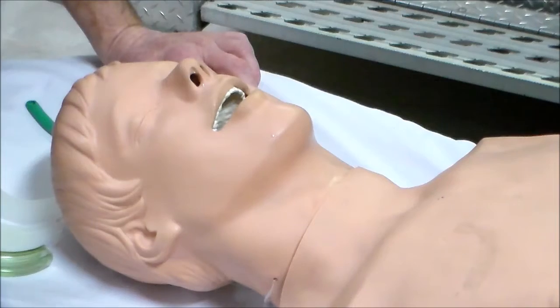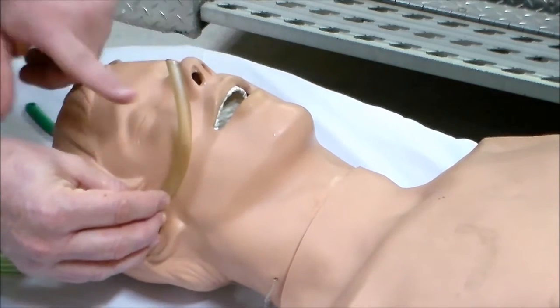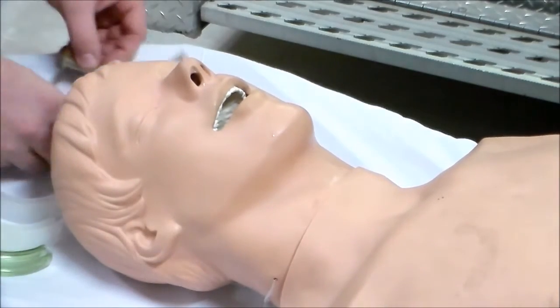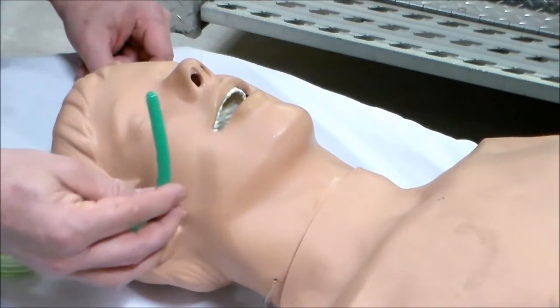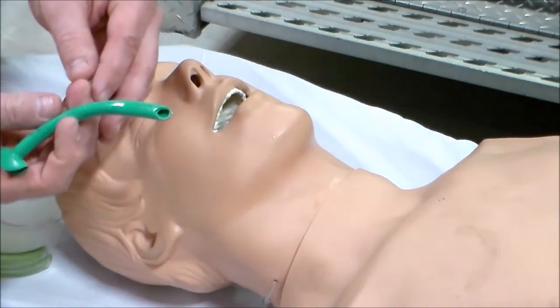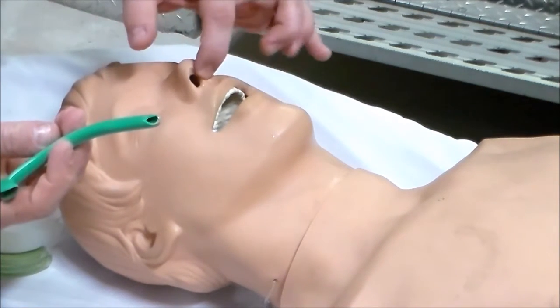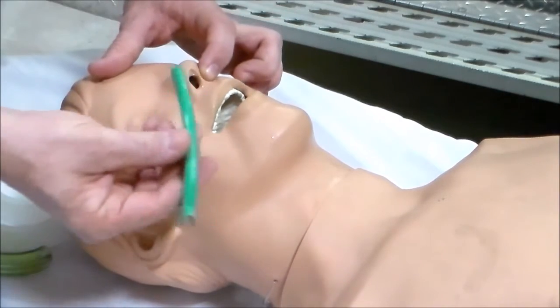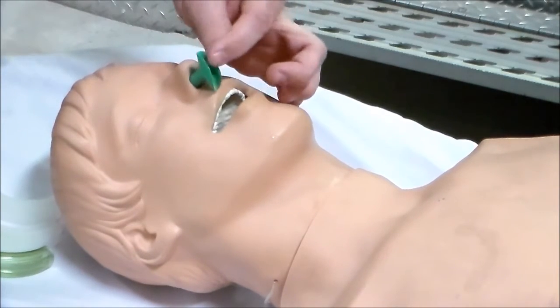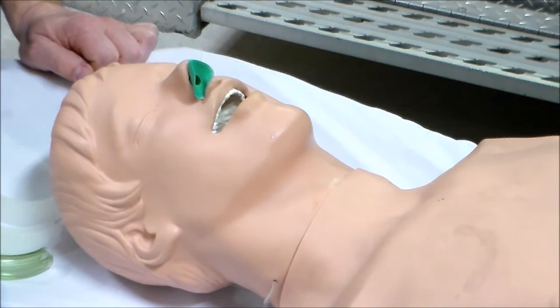For nasopharyngeal airways, we measure from the tragus of the ear to the nose. If it's a little too big, go to a smaller size — from the tragus of the ear right to the nose. Once lubricated, take the bevel toward the septum of the nose and insert into the right nare, and we have now inserted the nasopharyngeal airway.